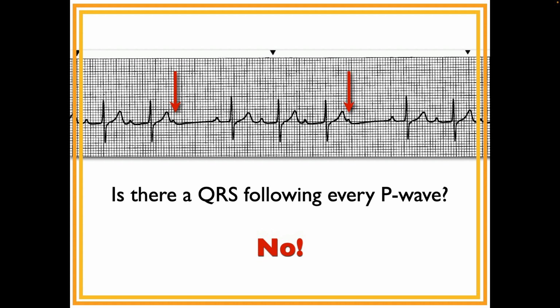Occasionally, I might ask you if something is normal or not, but by next week, the only rhythms that you're asked to identify are sinus rhythms, and what I will ask you is, what is the rhythm? Are there any pauses or blocks? Which by the time you take the quiz, you'll know. But I never ask you to go through the steps; you can do it on your own. I would never get them graded if for no other reason than that I'd have to do everybody's steps. But we do lots of practice in class, and that's where, if you're making mistakes, I'll pick it up there.